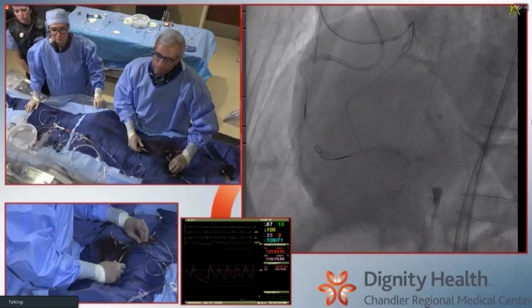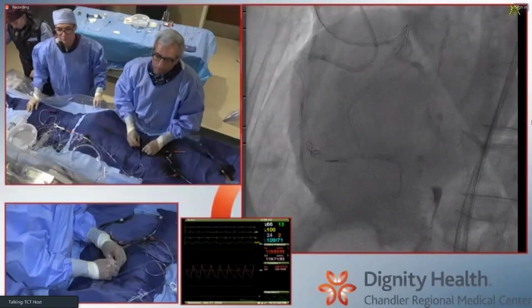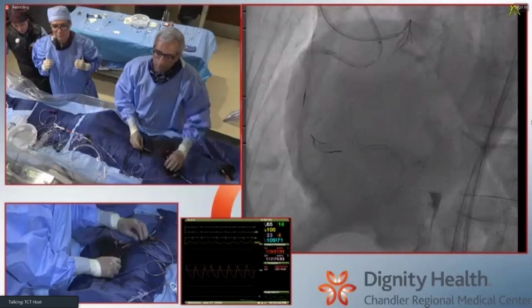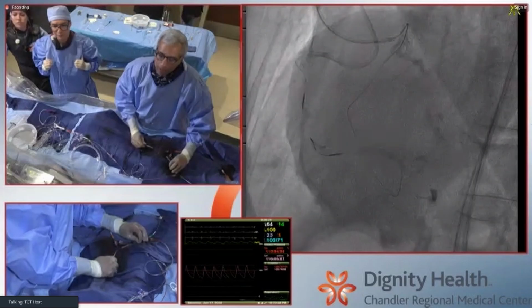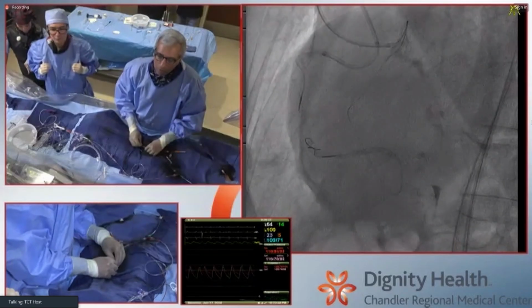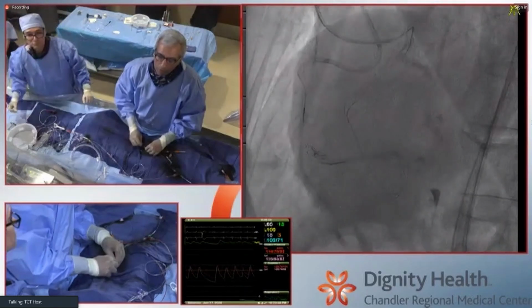So the other benefit of the Pilot 200, if you're coming retrograde with a knuckle and you had ambiguity, is that the knuckle will be a decent size. So it sort of helps resolve the ambiguity, though here I think you know exactly where you're going, with multiple different fluoroscopic markers. Gladius will produce small knuckles compared to Pilot, which produces comparatively large knuckles. So that is preferred.